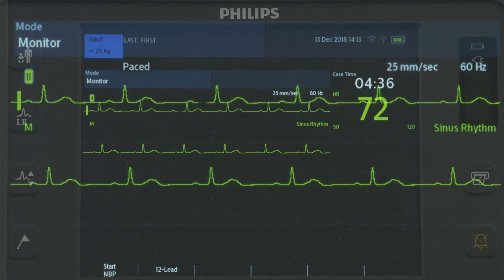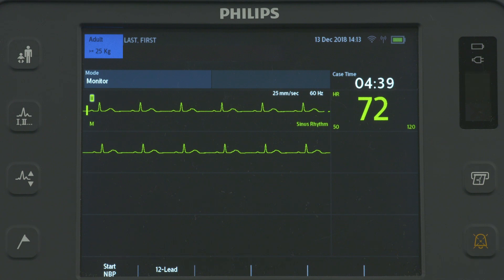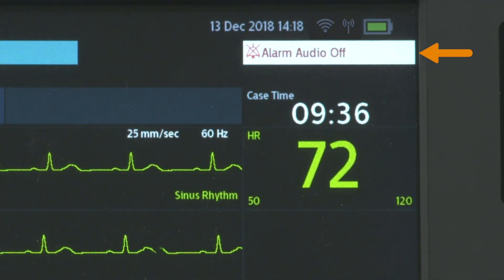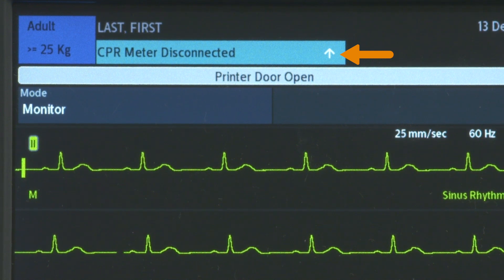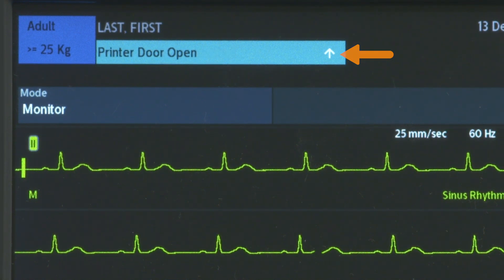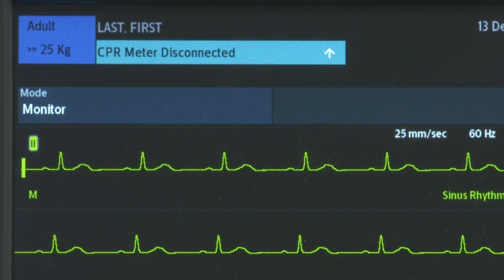Device information also displays, including the current state of clinical global alarms. When alarms are on and not paused, the indicator is blank. If alarms are off, a message appears along with an icon. Technical alarms indicating an equipment issue appear here, and the presence of a white arrow indicates there are multiple alarms.